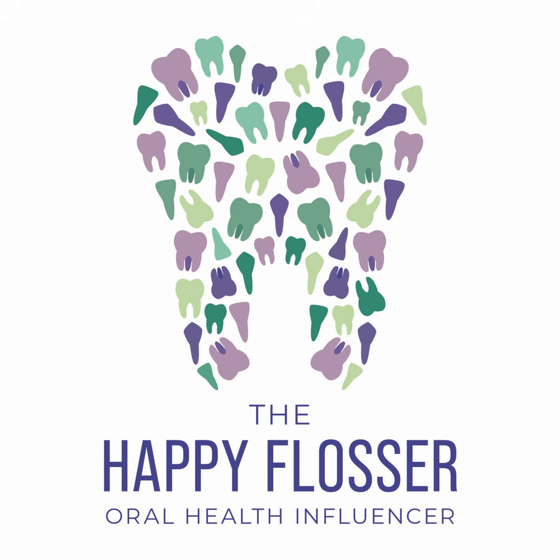So there are 5 objects that we take images of when we are using radiology in the dental setting, and each of those objects has a different level of density. So think about this. The air would be the most radiolucent of all of the objects that we take images of, right? And you'll see this on your radiographic image wherever there is nothing present in the mouth.